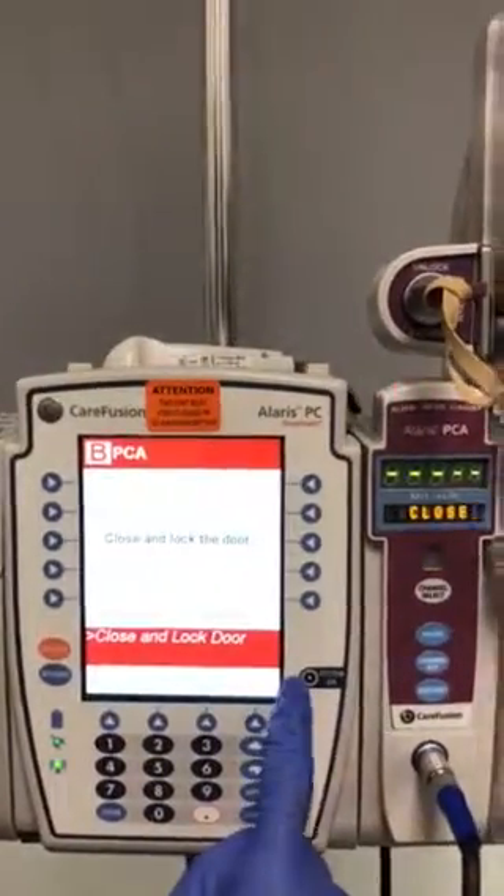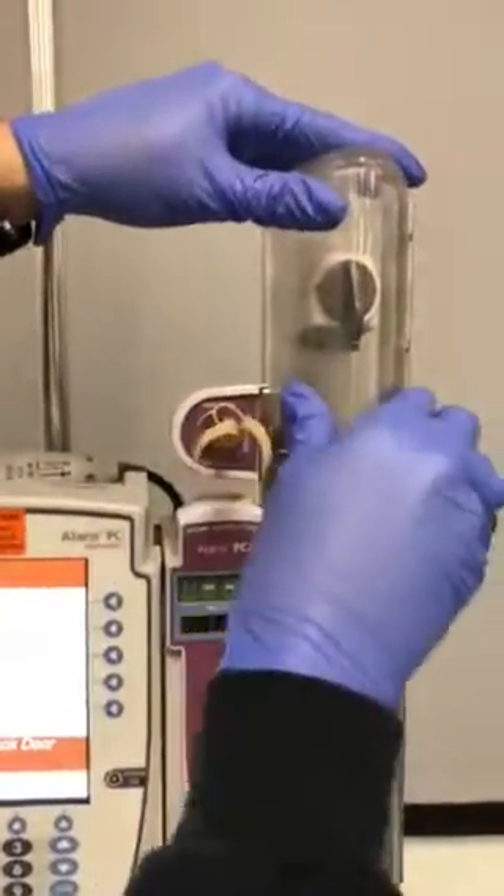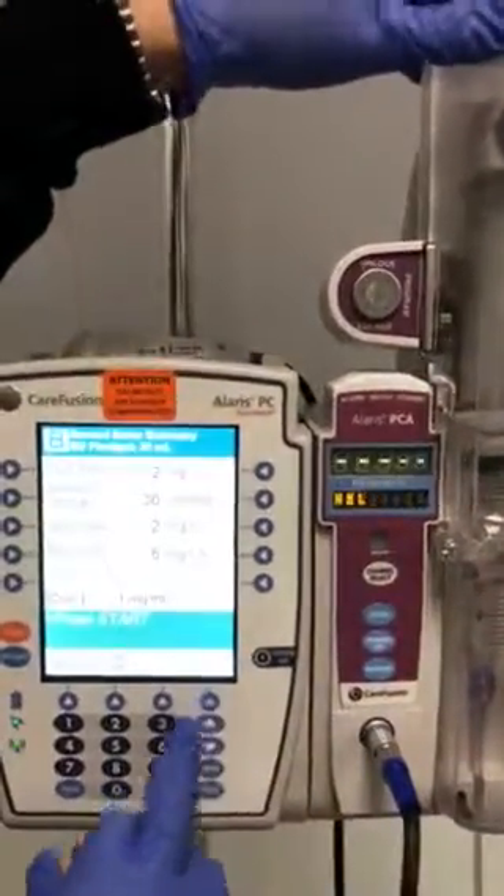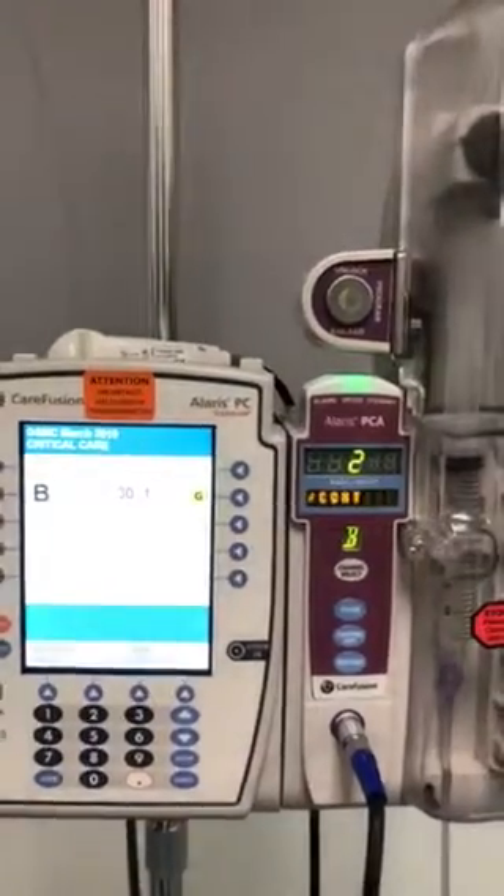You will see a screen that tells you to close and lock the door. Make sure it's locked and remove your key. Press start, and now your PCA is ready to go.